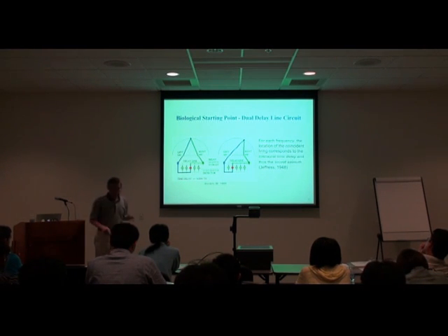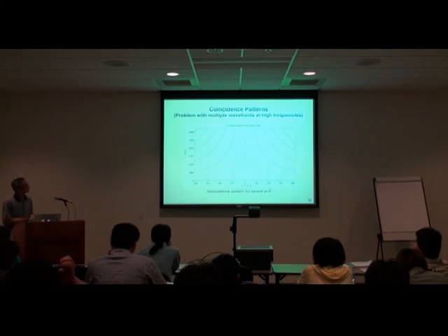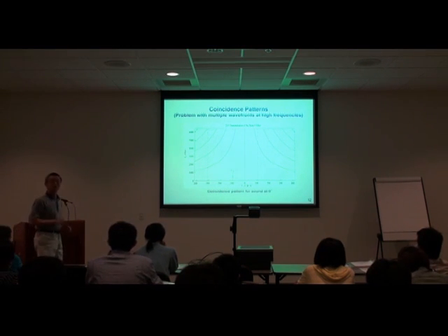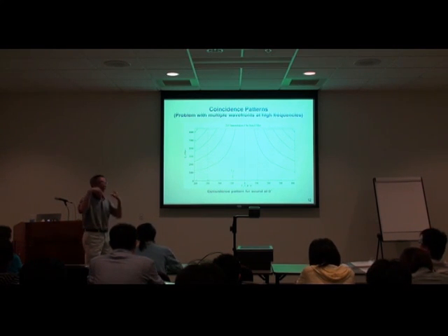It turns out that this coincidence detection scheme can be described by simple signal extraction, by subtracting the signal left and right. Not only does that give you the precise location of where the sound is, but it also gives you the ability to identify the content of the signal from that location.